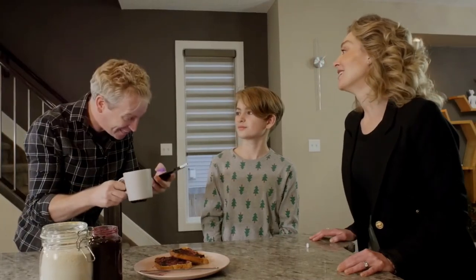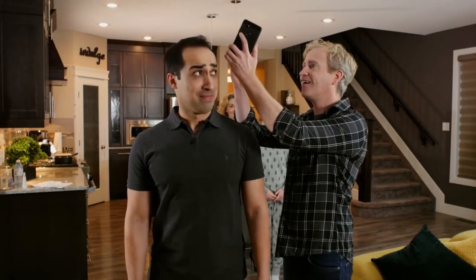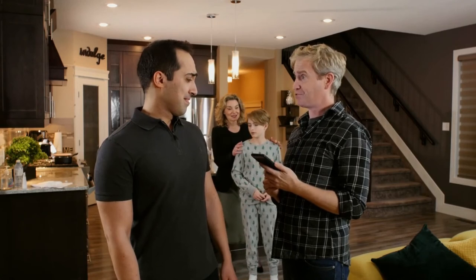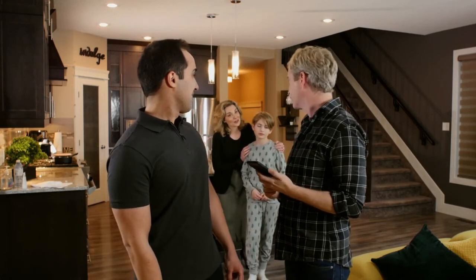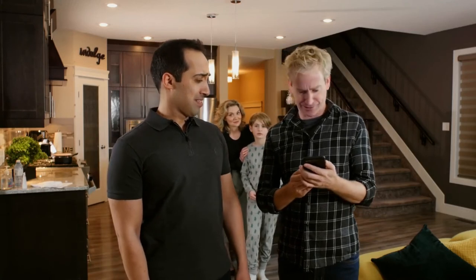Where did you get this? Hey, I'm Milad, founder of Utex Solution. TempBuddy is available here at Kickstarter. Please make a pledge and help us to bring TempBuddy to you and your loved ones. You have a healthy temperature, sir. Honey, don't bother the creator. Hey, sorry. I love your product. Thanks. It's so cool.